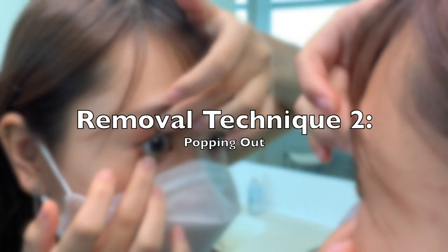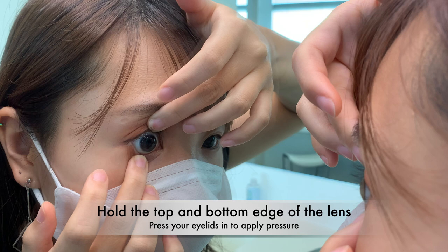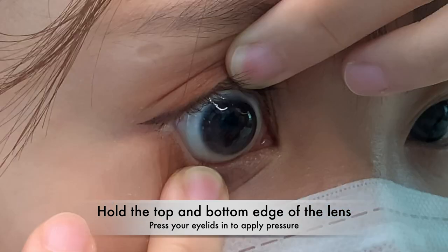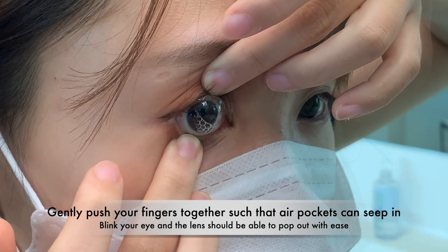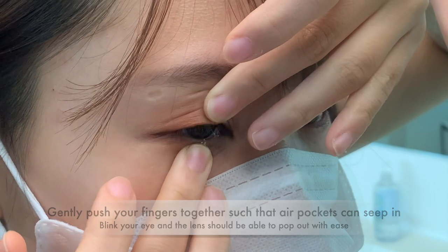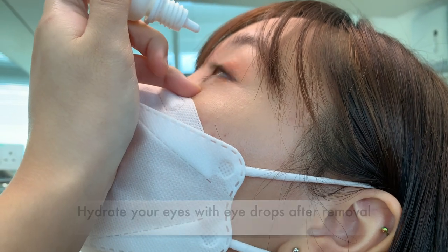Here is the second method for removing the lens. After loosening the lens, hold the top and bottom edge by pressing your eyelids in. Gently push your fingers together so that air pockets can seep in. Blink your eye and the lens should pop out with ease. Hydrate your eyes with eye drops after removal.